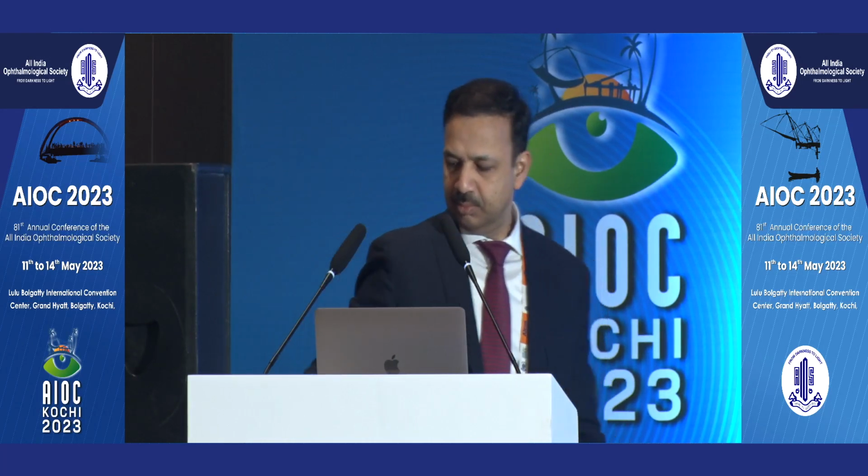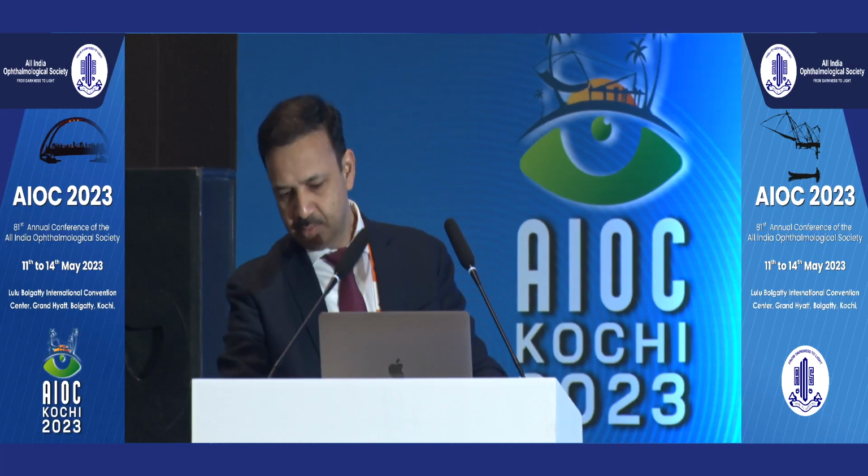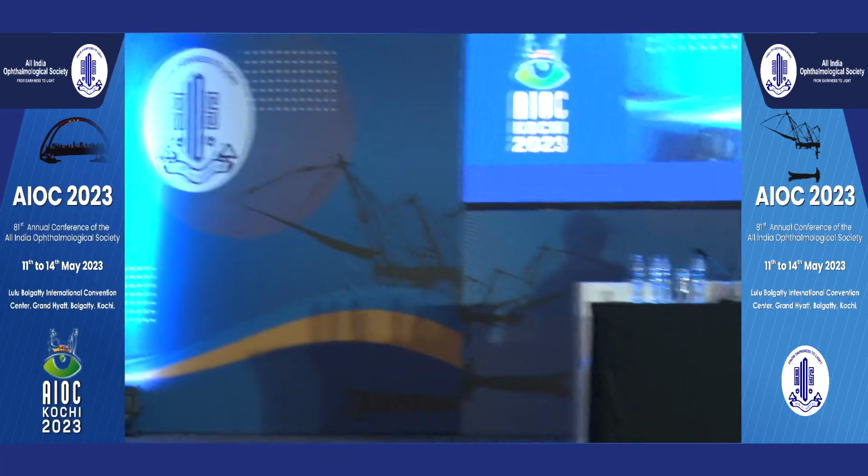The incision. So I think Dr. Basak has taught us to do superior. No, it is not that. It is my problem of going temporal. It is my physical problem. So I do cataract surgery also superior. I have a different kind of table for myself. I have designed it.